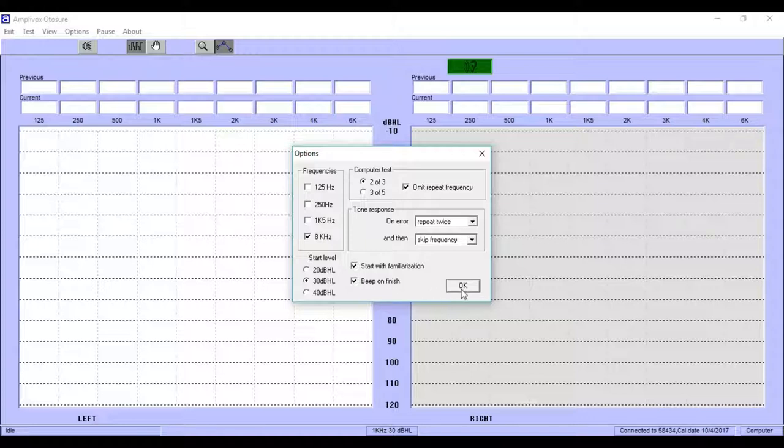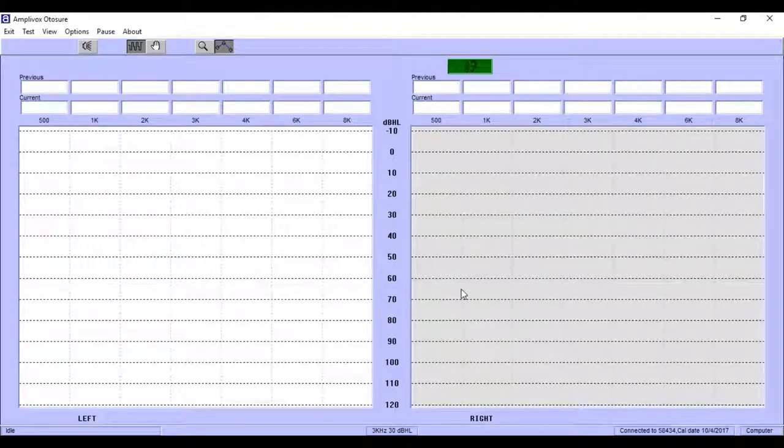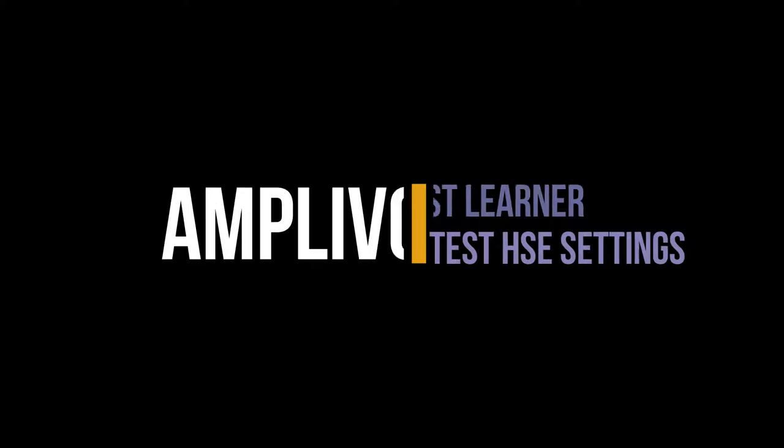This fast learner video summed up how to set your protocol settings of the Amplivox audiometry module according to the HSE standard. You will find another video on our YouTube channel explaining each setting in detail.